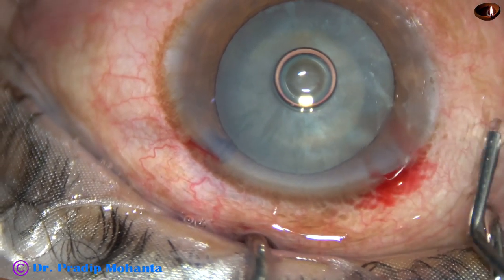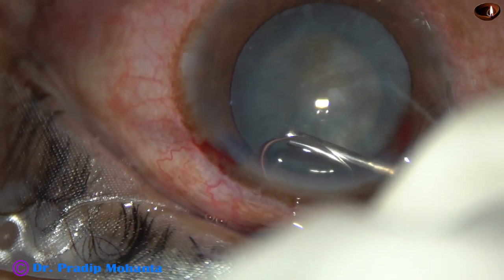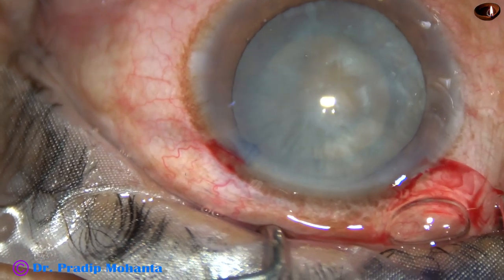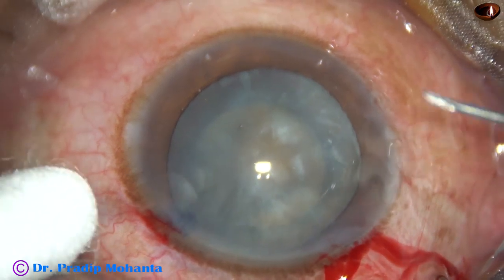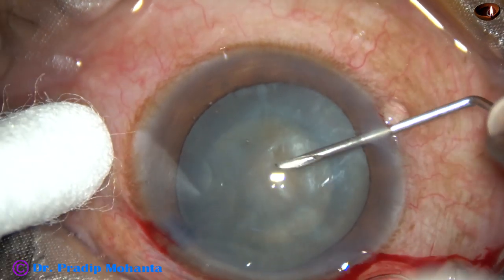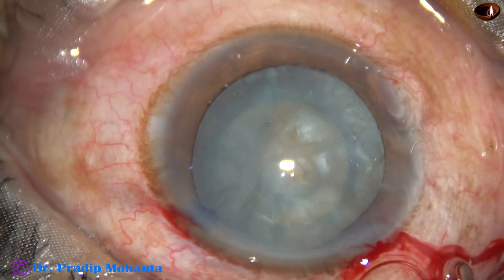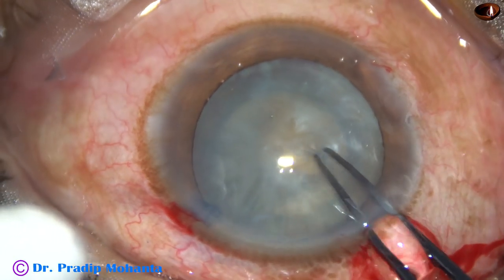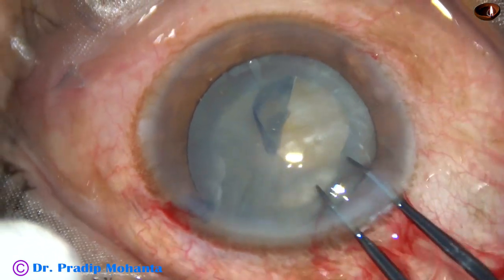2% hydroxypropylmethylcellulose is injected into the anterior chamber. The anterior chamber is filled up with this viscoelastic substance. Now I take a 26-gauge needle — it will go through the right side port to incise the capsule. And here we see that there is nothing coming out.